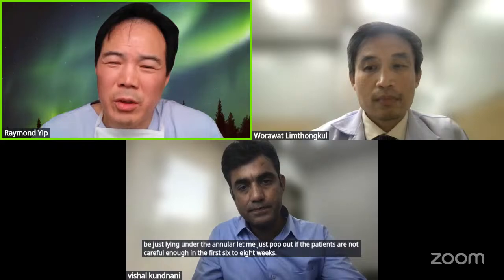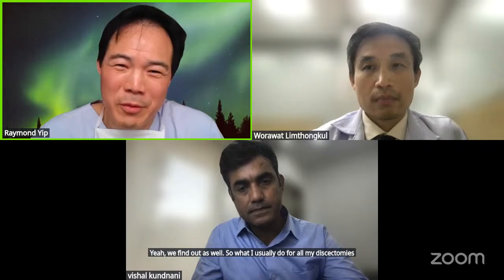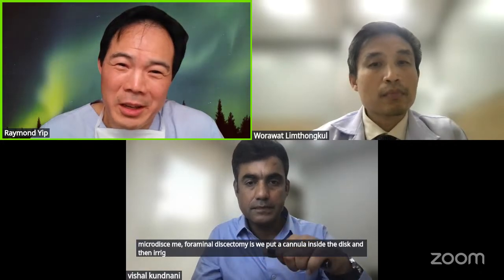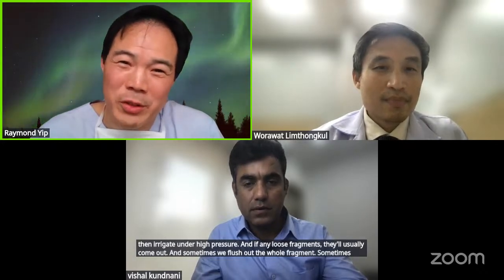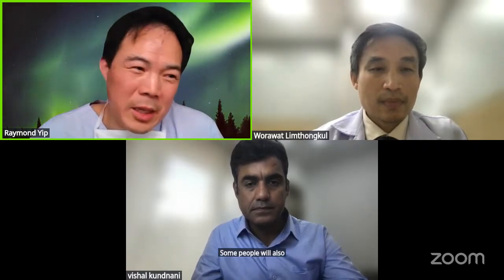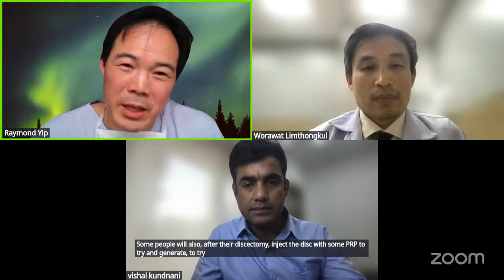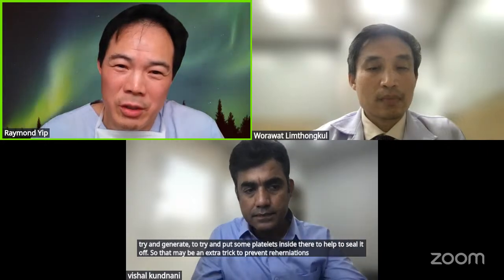Yeah, we find that as well. What I usually do for all my discectomies, microdiscectomy and foraminal discectomy, is put a cannula inside the disc and then irrigate under high pressure. If there are any loose fragments, they'll usually come out. Sometimes we flush out and the whole fragment dislodges. When you pressurize the disc, something comes out, and that's a loose fragment. So I irrigate it thoroughly, and hopefully we'll get something out. Some people will also, after their discectomy, inject the disc with some PRP to put some platelets inside there to help seal it off. That may be an extra trick to prevent reherniations and further disc degeneration.